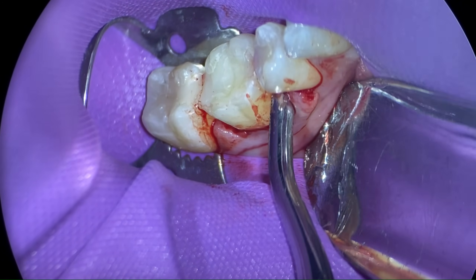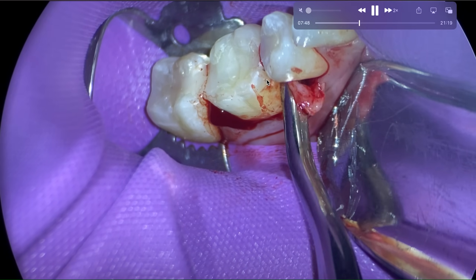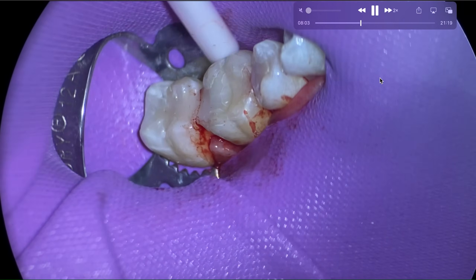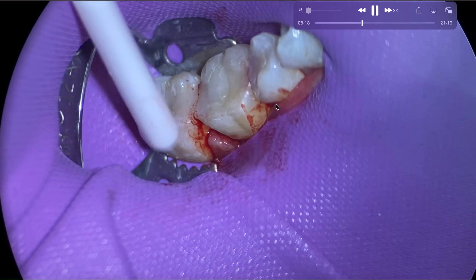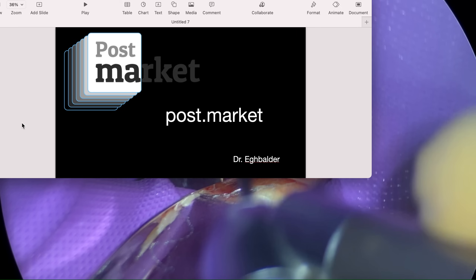We're going to get some mobility with nice, slow, continuous forces. I'm not going to take forceps on here because this is root canal treated and cracked — it's going to fracture into a thousand pieces. As fun as it might be to have a crown fracture into a million pieces, it's not enjoyable for a patient. So let's review: we've numbed her up, we have mobility on the tooth. We're going to section the tooth. Looking at the tooth diagram, from the tip of the mesio-buccal cusp to the roof of the pulp chamber we've got six millimeters, to the bottom of the pulp chamber eight millimeters, and from the top of the mesio-buccal cusp down to the furcation we've got 11 millimeters.